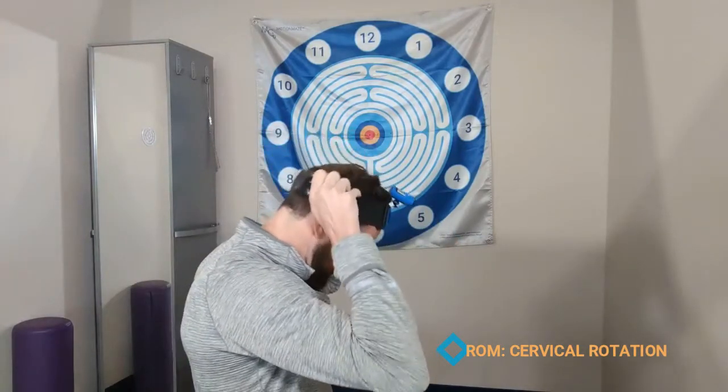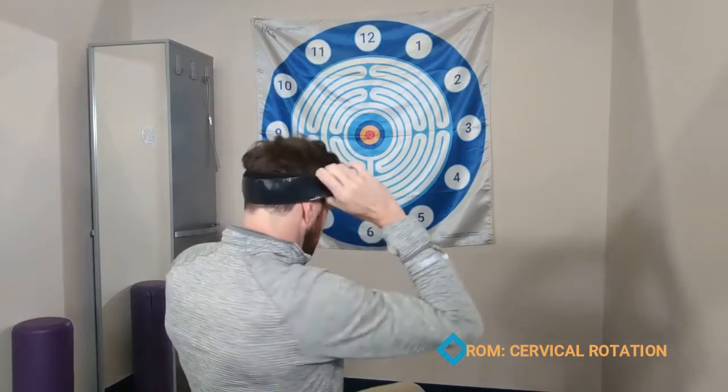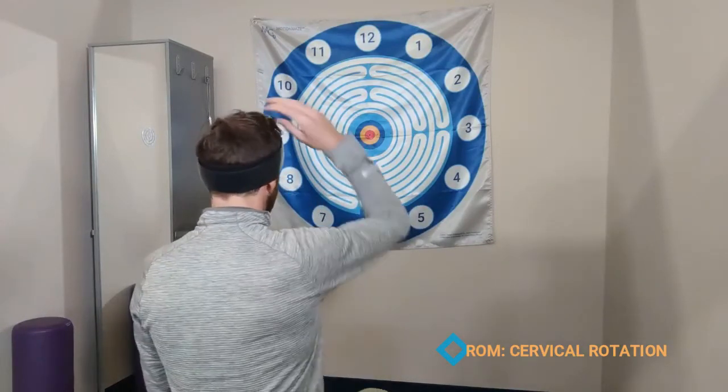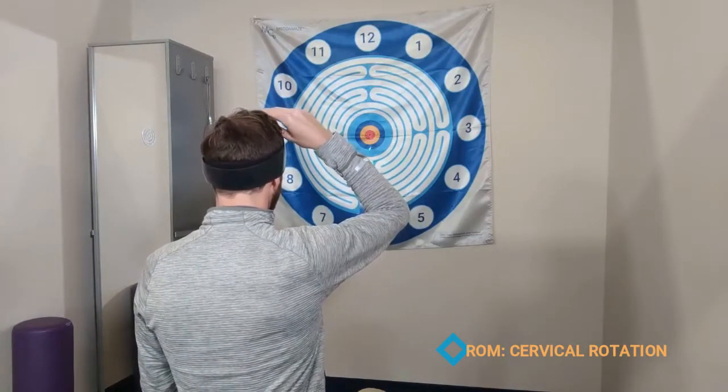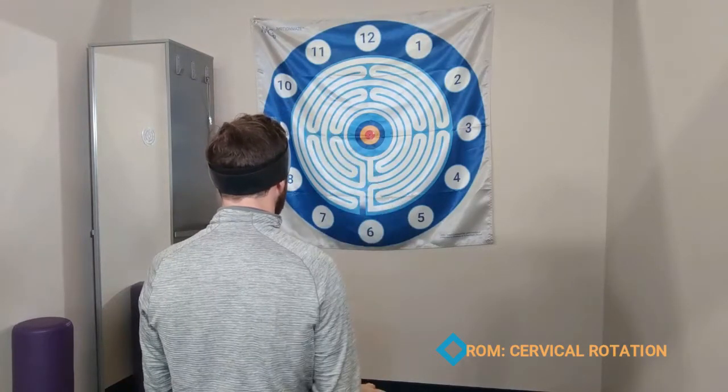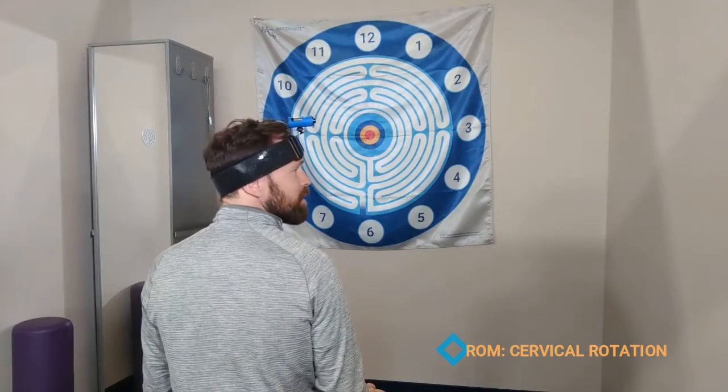Putting on the head strap, you can have someone standing at the flag — I'm just sitting on a rolling stool. Let's have them look at the center and calibrate that to the center by aiming the laser right where they're looking and just turning their head left and right.